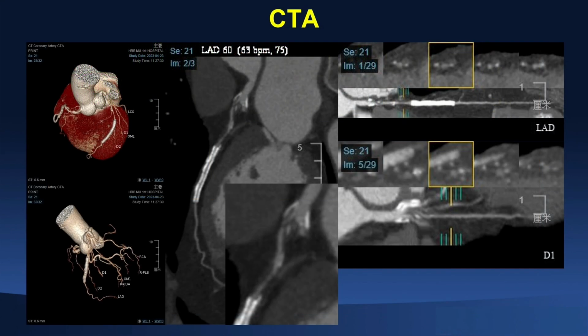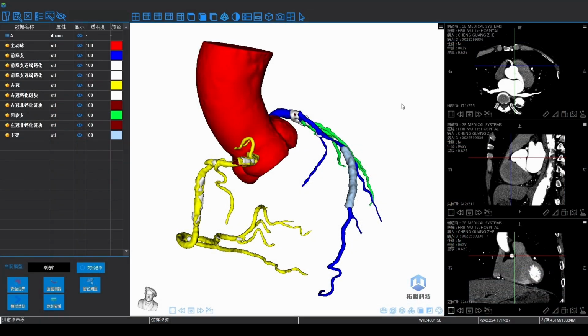We can see the proximal LAD image is blurry, and it is difficult to evaluate the plaque feature even when the image is magnified. In this situation, it is impossible to make a detailed PCI plan before the procedure. Now you can see the intelligent visualization system for coronary CT angiography, which was originally invented by Professor Li Yue, just like the system we showed in the former cases.